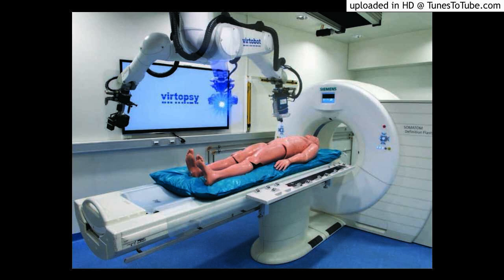The teeth have been a primary means for individual identification in single cases as well as mass disasters, which includes comparing postmortem dental radiographs to antemortem records. The use of CT is a new modality for this purpose.